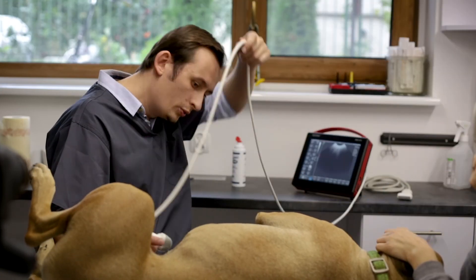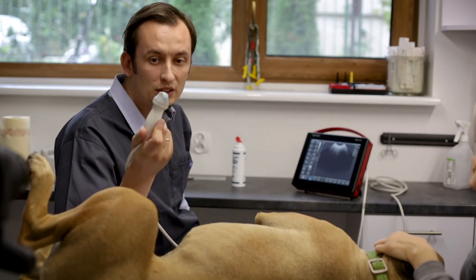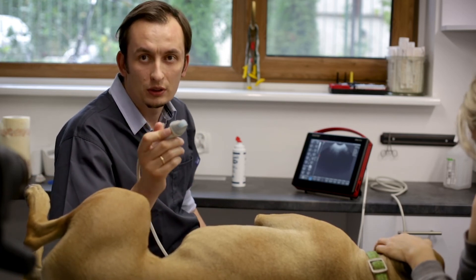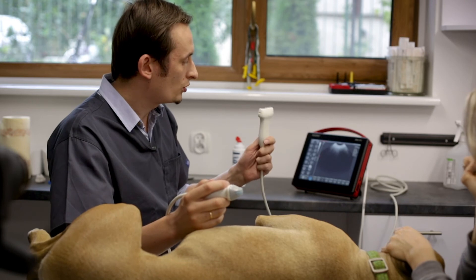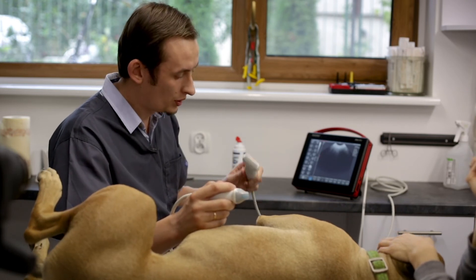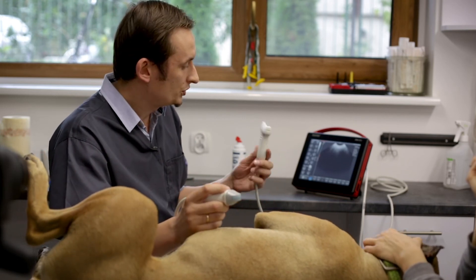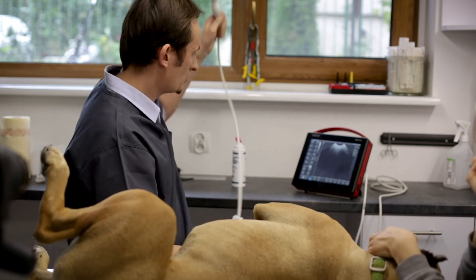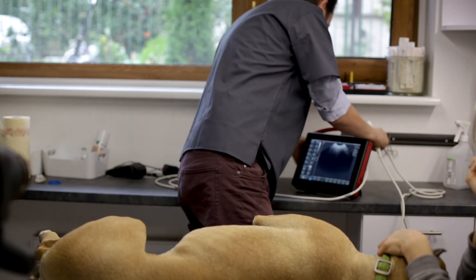You also asked me about which probes to use in the small animal clinic. The standard probe is the microconvex, and I think about 80 percent of your patients can be examined with this probe. But if you want to see more details in the near field, or you have a lot of small patients like Yorkshire terriers or cats, you should think about having an abdominal linear probe — higher frequency; this one is 10 megahertz. I'll show you how the image looks from this probe.